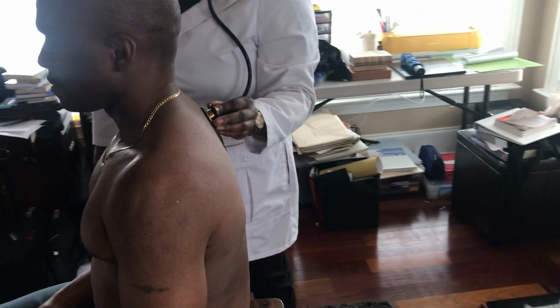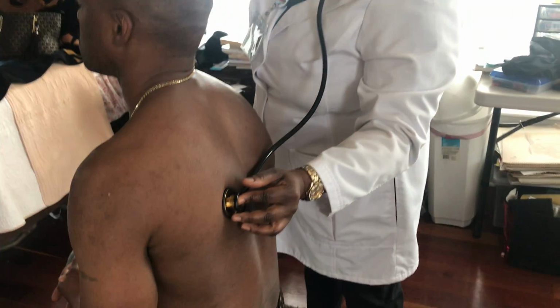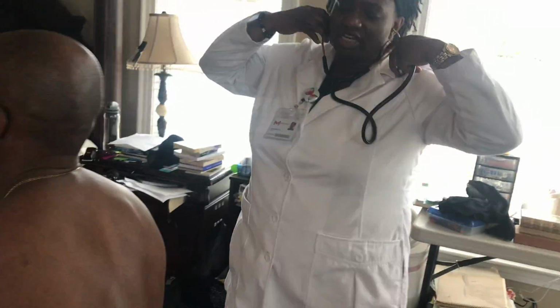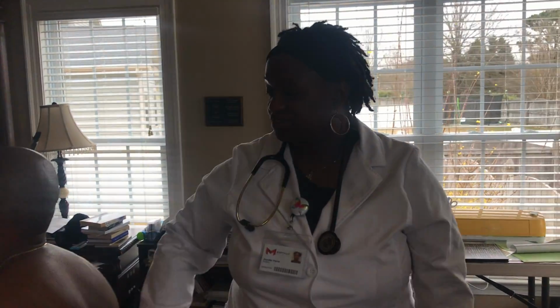Take a deep breath. With the lung sounds, I'm just listening for any crackles or any abnormal breath sounds anywhere.